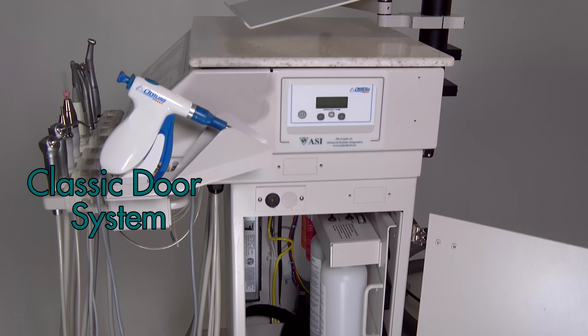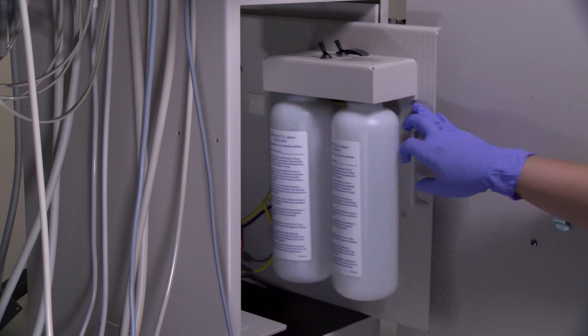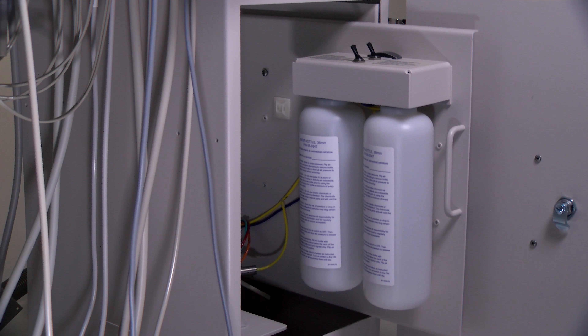The Classic Door System is a fully functioning dental delivery system with a door on the right side of the chassis that provides convenient access to concealed water bottles inside.